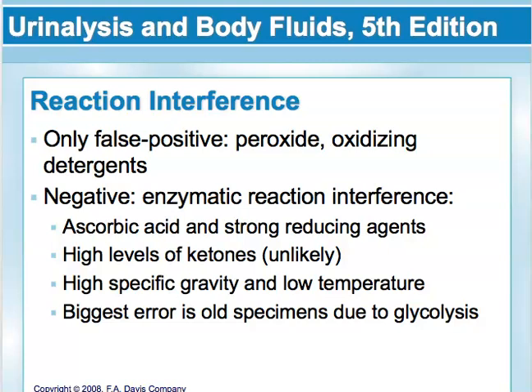High specific gravity and low temperature may decrease the sensitivity of the test, but the greatest source of false negative reactions is from allowing the specimen to sit unpreserved at room temperature for extended periods, which allows bacteria to utilize the glucose.